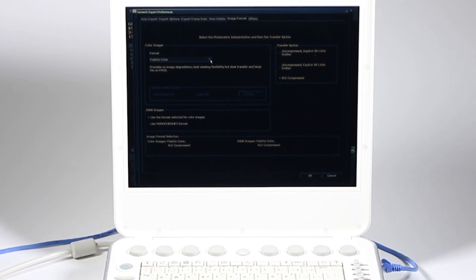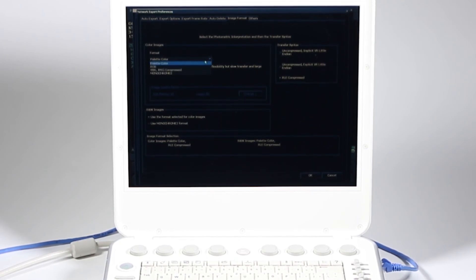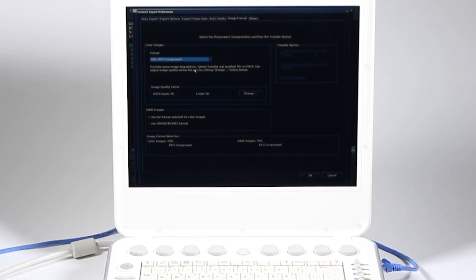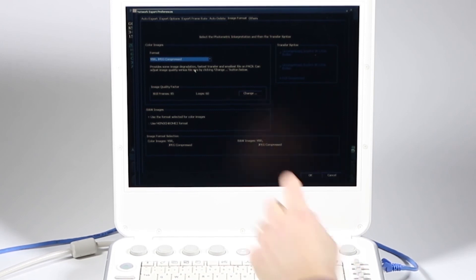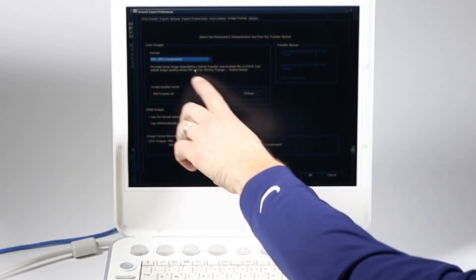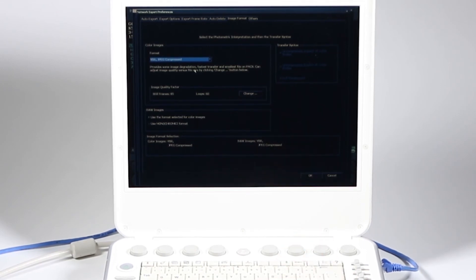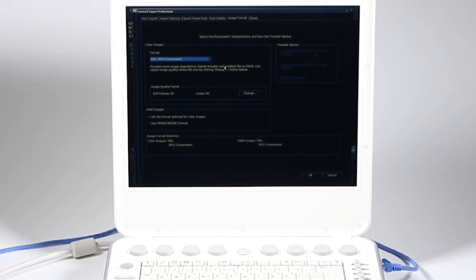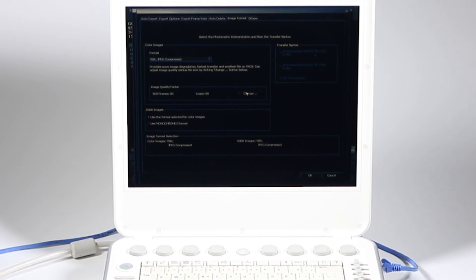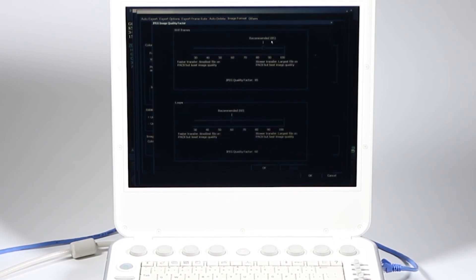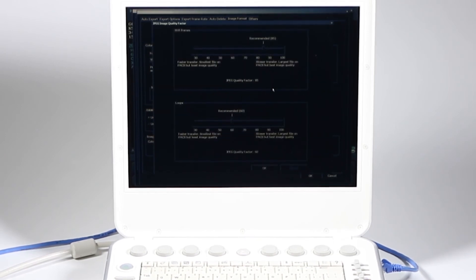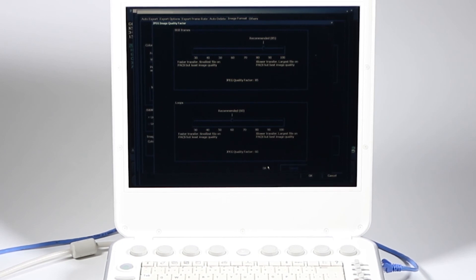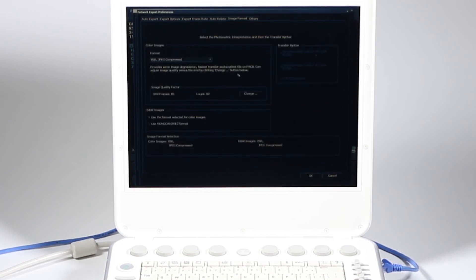Generally for images, you can use YBR JPEG compressed, and check with your IT person to find out if that's best. But the best part about this system is it's going to tell you what happens when you choose each format. This provides some image degradation, faster transfer and smallest file size on PACs. It says recommended is 85%. It's going to be a much smaller file than if you went with uncompressed, like maybe 5% as large as the uncompressed, especially in video clips.